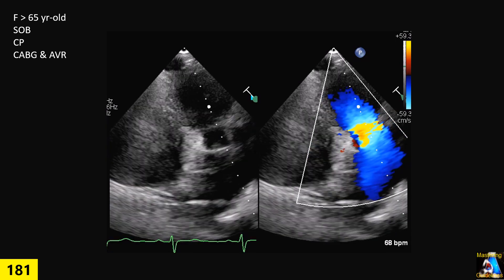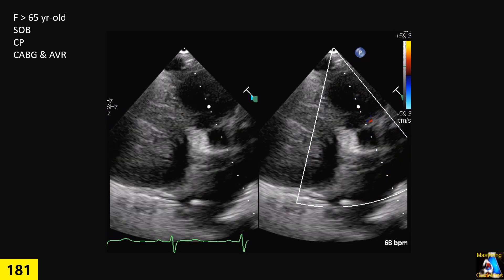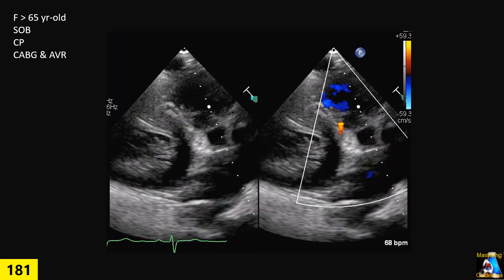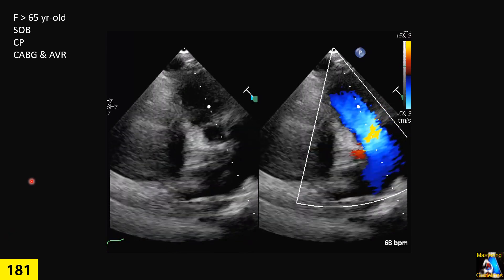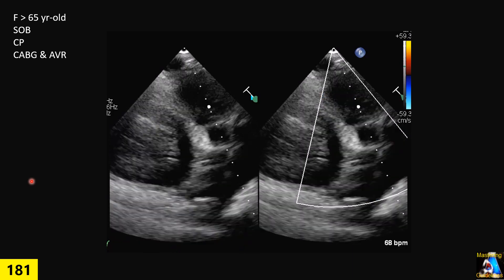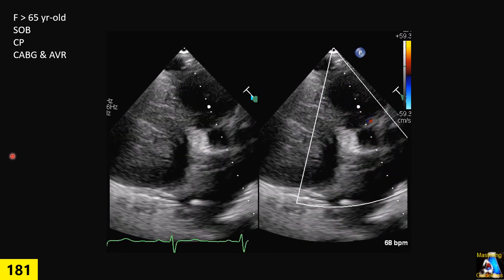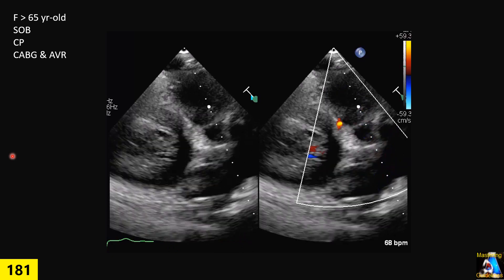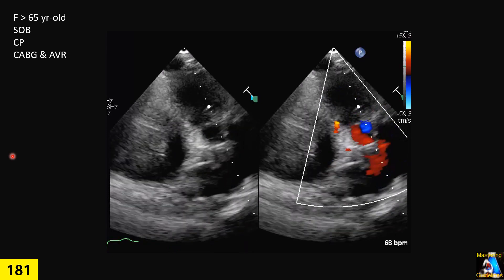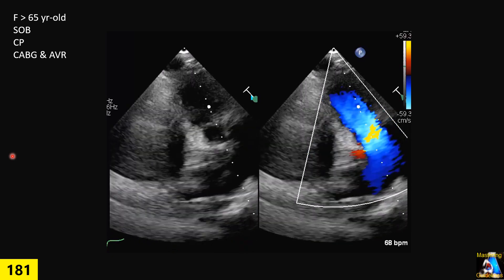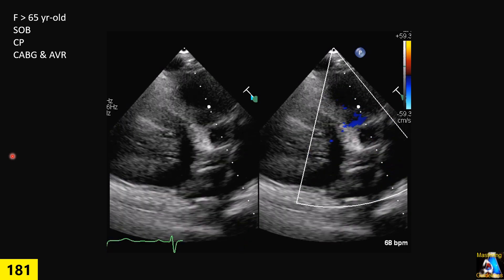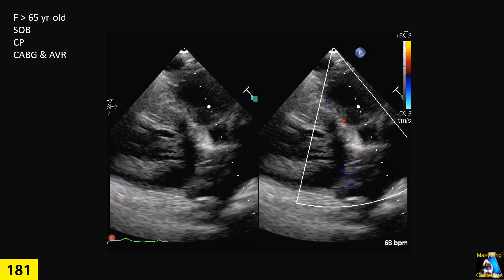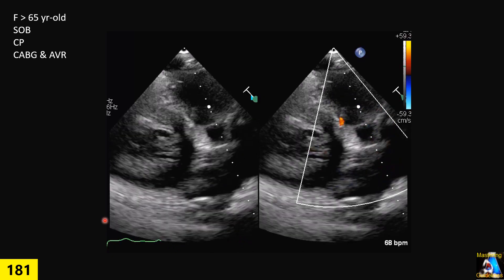A patient over 65 years old came to the emergency with shortness of breath and chest pain. The patient had CABG, multiple vessel triple bypass, and AVR about 12 years ago. We did a study on ECHO, and the patient had severe aortic stenosis on the artificial valve.